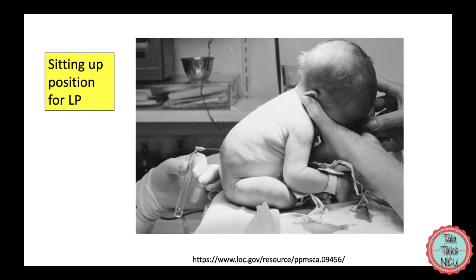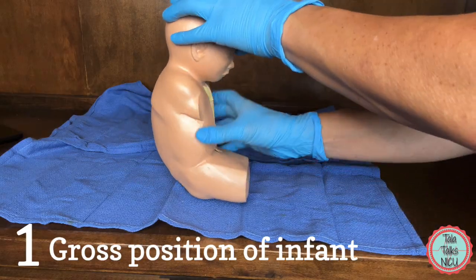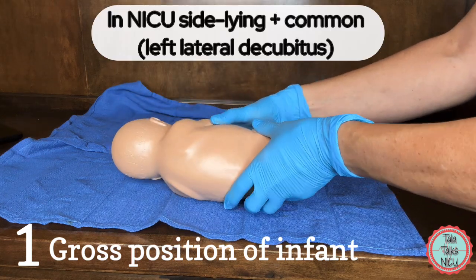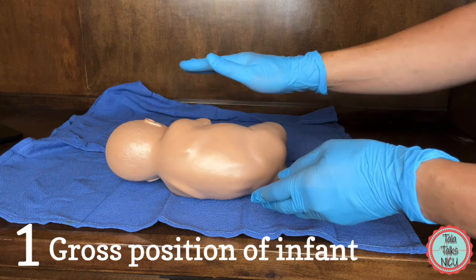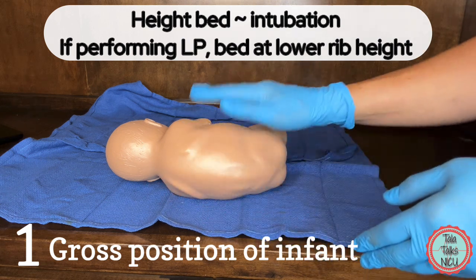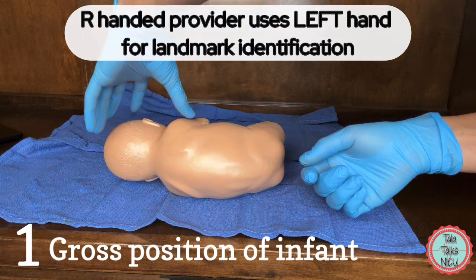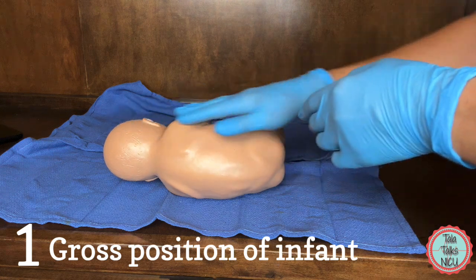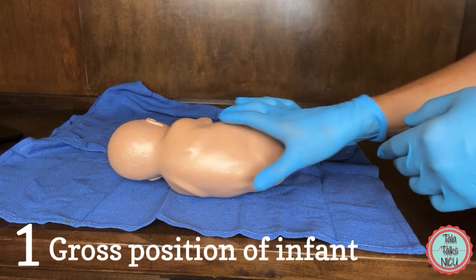I'm used to using the sitting position with older kids, but honestly I can't remember the last time I've seen anyone do this in the NICU. In a sitting position, you're bending the baby over with the face pointing towards the baby's knees. More commonly we do the side-lying position, which I'll focus on here. The table should be at the level of the lower ribs of whoever's doing the tap. Being right-handed, I prefer the baby in a left side-down position — like shooting a left lateral decubitus x-ray with the liver up.